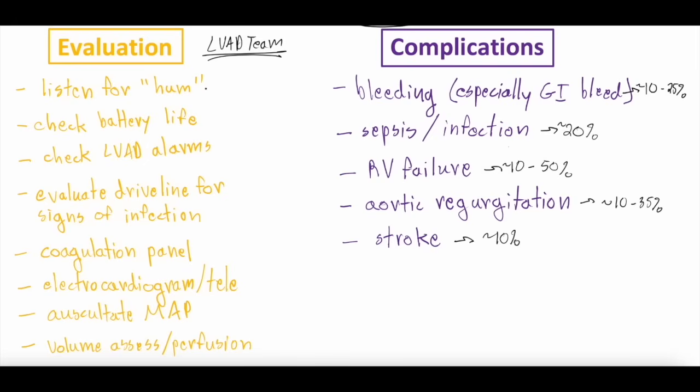You can auscultate the heart and listen for a hum, right? You should hear a hum. This is literally the machine, the LVAD pump, working, so you should always hear a hum. No hum, bad news bears. Always check the patient's battery life. Again, if the patient is not physically plugged in to charge, they have a battery, and those batteries die. And if the battery's dead, the LVAD pump is not working. So always check the patient's battery life.